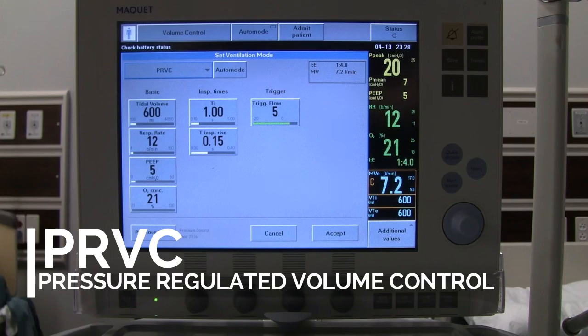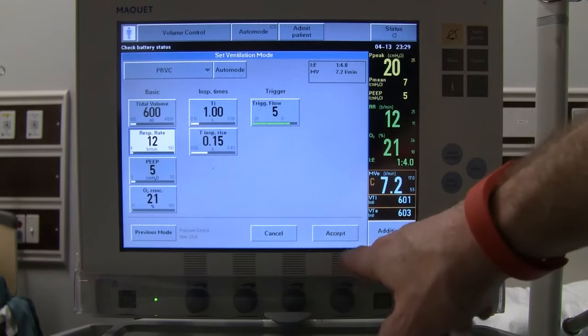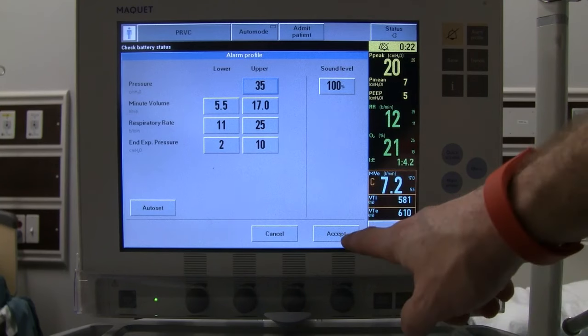Now we'll briefly discuss some of the advanced modes on the Servo-i. First is PRVC — pressure-regulated volume control — which combines the advantages of volume and pressure-controlled ventilation. It delivers a preset tidal volume at the lowest possible pressure, with inspiratory pressure constantly adapting by small increments to guarantee the set volume. The flow pattern is decelerating. The peak inspiratory alarm determines the highest allowed pressure, and a red audible alarm sounds when peak inspiratory pressure reaches 5 cmH2O below the set alarm level.